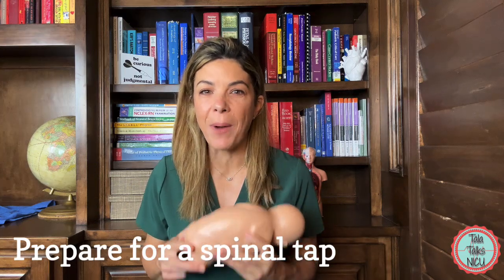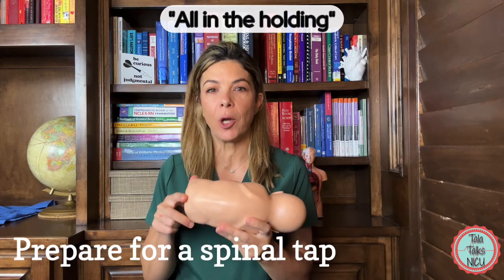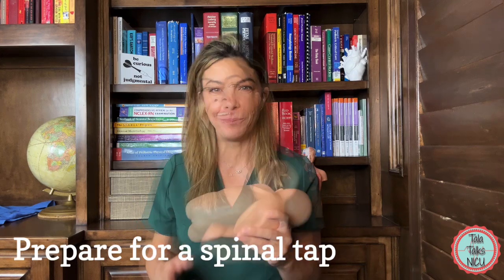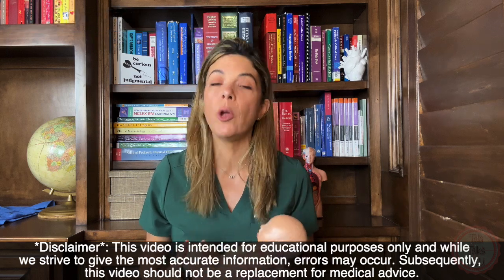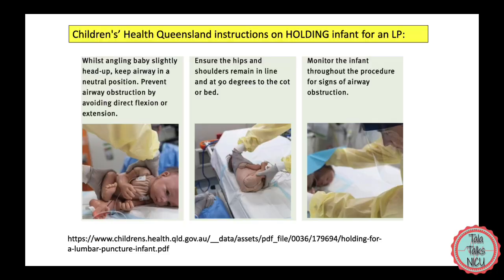You know how they say that spinal taps are all in the holding? Today we're going to go over how to hold a baby for the spinal tap so you can be the best possible holder in the NICU. Hi, I'm Dr. Tala, and I've been a neonatologist for 16 years. As you all know, we do a lot of lumbar punctures in the unit, and a really good holder makes spinal taps so much easier.